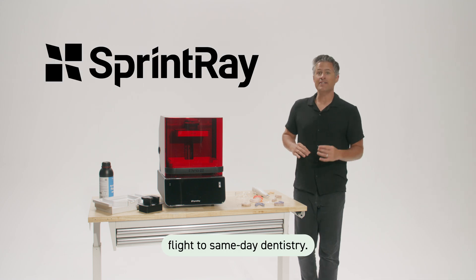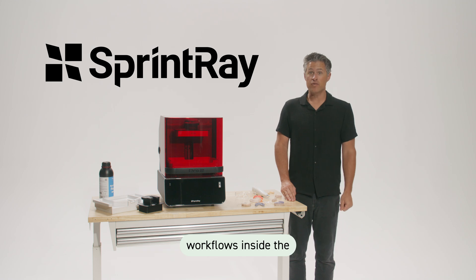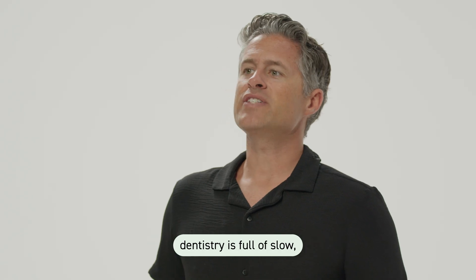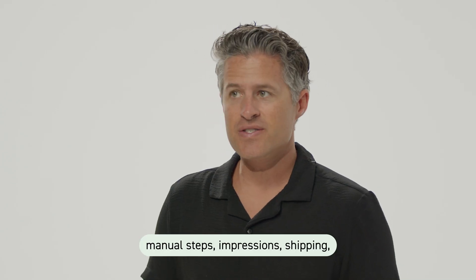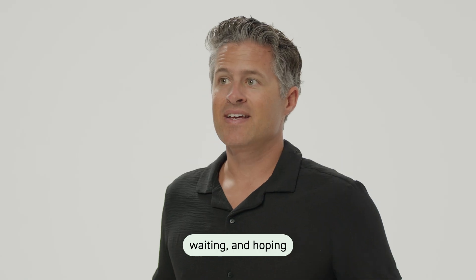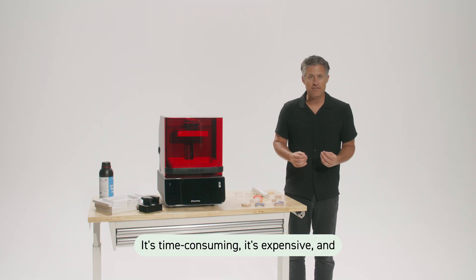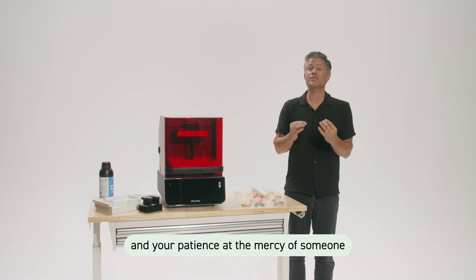Welcome aboard this flight to same-day dentistry. Please keep your arms, legs, and outdated workflows inside the operatory at all times. Traditional dentistry is full of slow, manual steps — impressions, shipping, waiting, and hoping the lab gets it right. It's time-consuming, it's expensive, and it puts your schedule and your patients at the mercy of someone else.